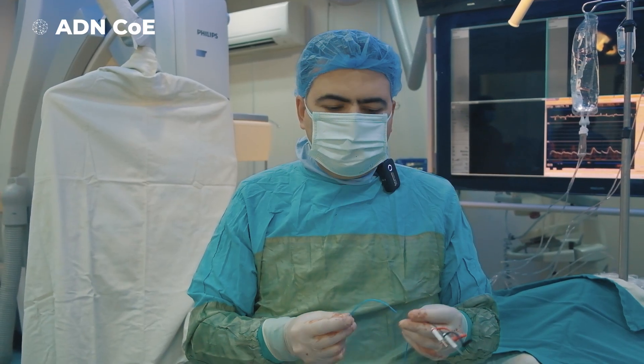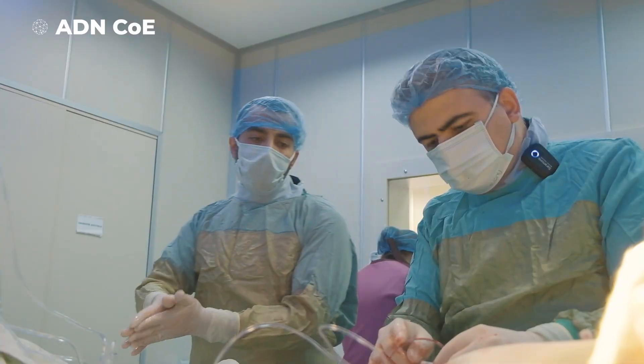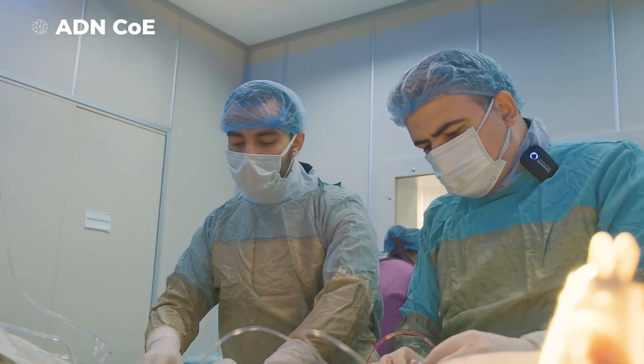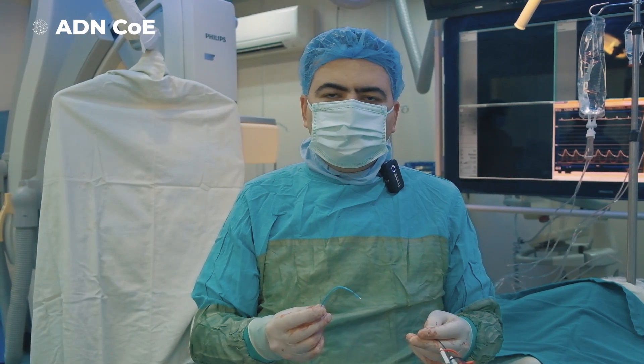We are inserting a temporary pacemaker because, as you know, there is a small chance of rhythm abnormalities during the procedure.